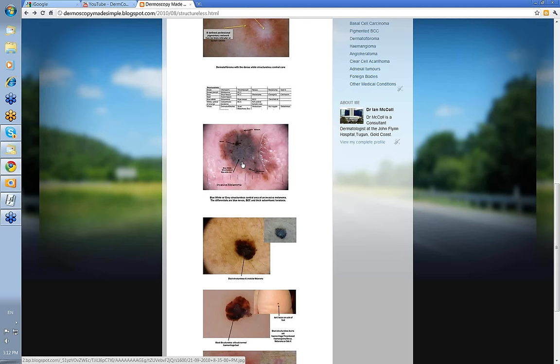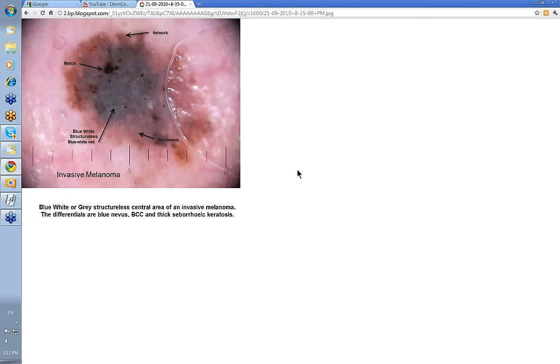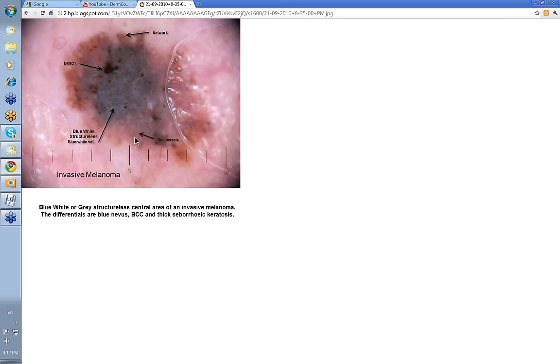What about blue or black Structureless? This one here is mainly blue-gray — look at that blue-gray color. This was an invasive melanoma. Remember those differentials: blue nevus, BCC, seborrheic keratosis. You might look at this and think there are some elements suggesting seborrheic keratosis, but there are dot vessels within this — you don't usually see those in seborrheic keratosis, which usually has looped vessels.